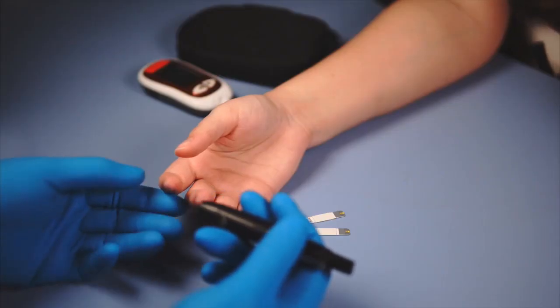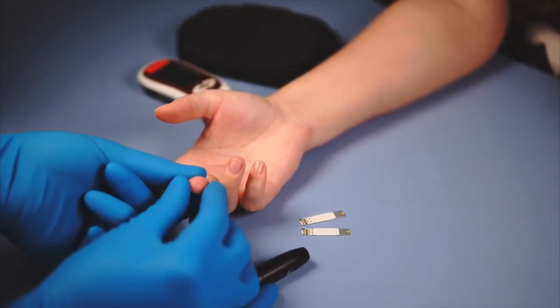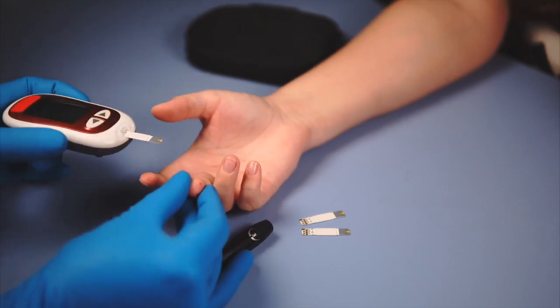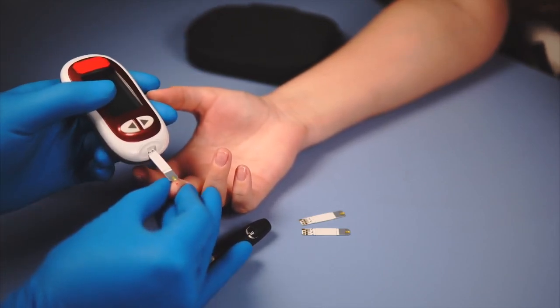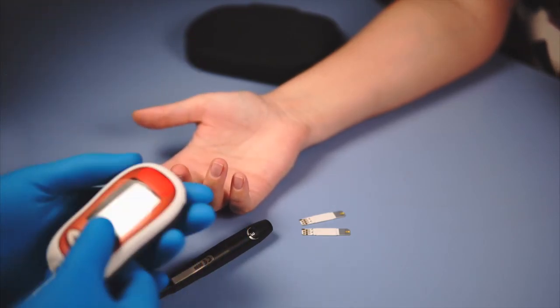The most common method is still using a glucose meter combined with a test strip. You have a small device called a lancet device, you use it on the tip of your finger, pull out a little bit of blood, and then very rapidly — within seconds — you can measure your blood glucose levels. This test can only measure blood sugar levels at one moment in time, so if you have to measure throughout a day, you have to do it multiple times. The big advantage is that this test is extremely rapid and works with very low cost technology, so it's very accessible.